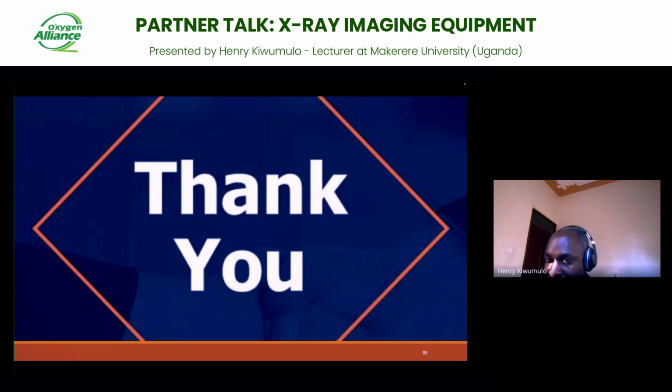Yeah, thank you so much, Foster. Thankfully, I hadn't had the first question, but I think, Foster, you had it well and you've answered it. So the second question, which I vaguely had, was, does the mobile X-ray have a generator? So yes, it has. A generator is a generic part of an X-ray machine. An X-ray machine, no matter what type or what modality, must have a generator.